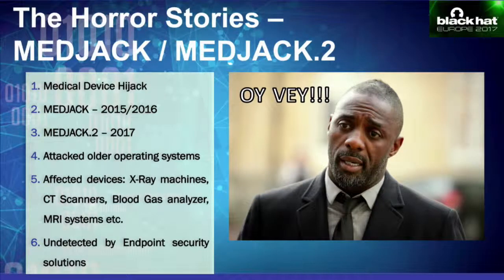One important thing about MedJack was that it went undetected by a lot of endpoint solutions. Why that happened was because MedJack was only targeting older operating systems and older, outdated vulnerabilities. When that malicious packet reached a modern operating system, it was already patched against it. So it simply ignored the packet. It didn't even reach the endpoint solution.